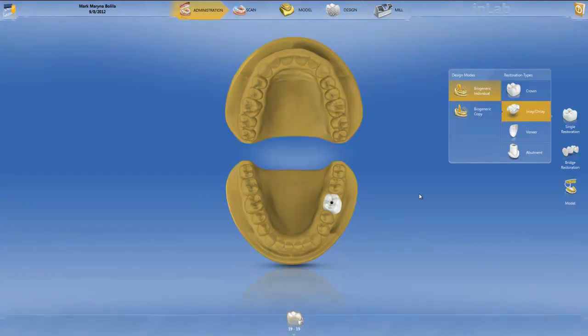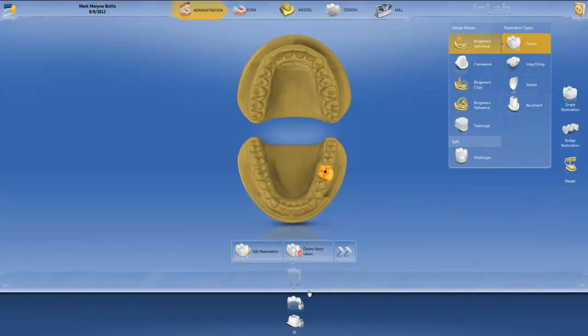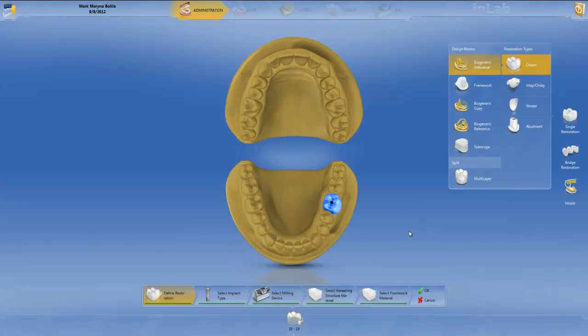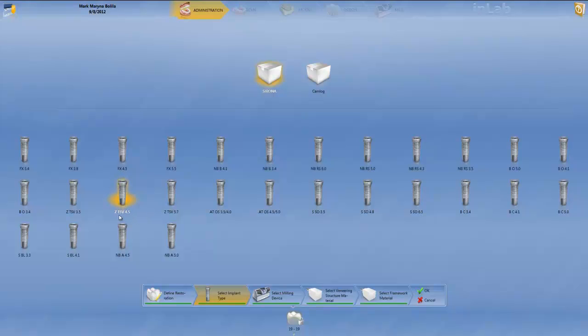Now let's start designing crown number 19 with the implant abutment. Before designating the crown, we choose Single Restoration, then Crown, then Biogeneric Individual Multi-layer, and click on tooth number 19. If you choose it correctly, you will see two restorations: one is the Abutment and the other is the Crown. We're designing a crown that we'll split — that's why we choose Multi-layer. In the Edit Restoration screen, we choose the implant type: 4.5 by Zimmer, even though I placed a 6.0, because of the platform switch — to ensure a nice emergence profile and fit the restoration to the implant side.